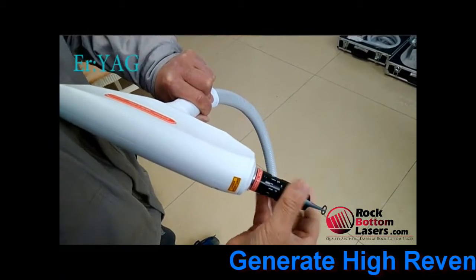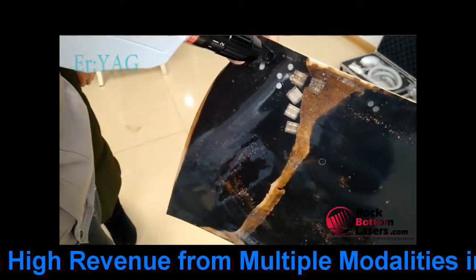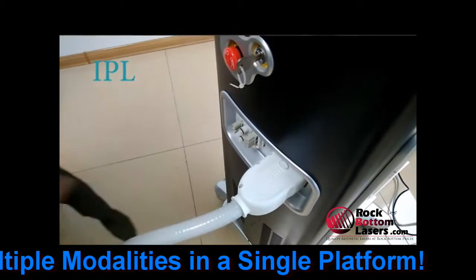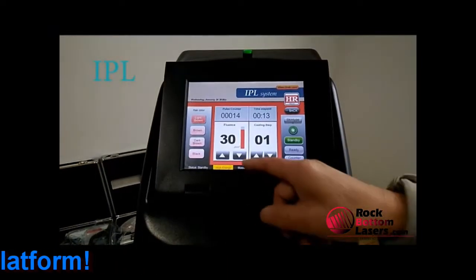It also has a tattoo removal handpiece so you can add tattoo removal to your practice. It's a very nice device because it does allow you to generate so many multiple streams of revenue from it, and it's priced very competitively.